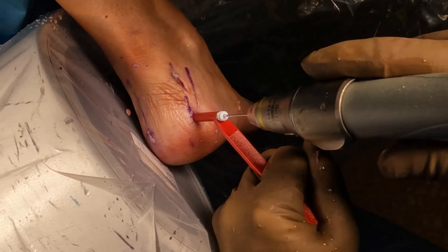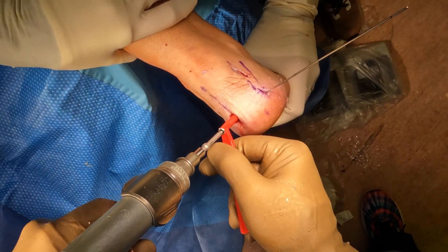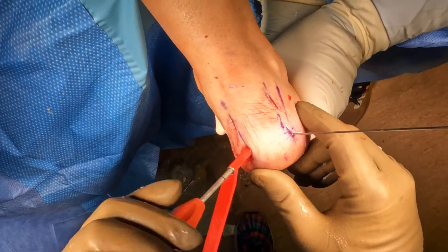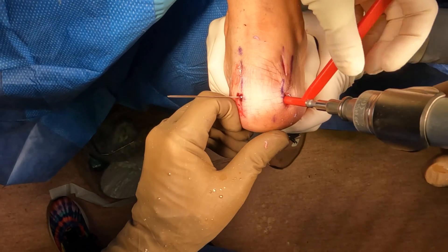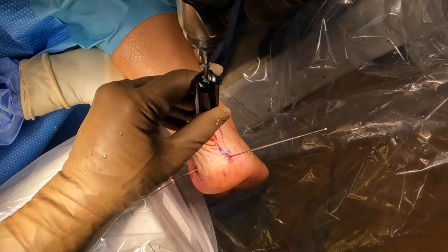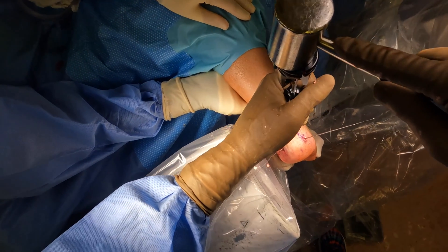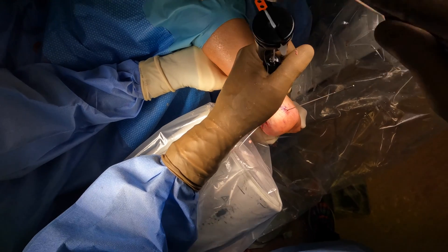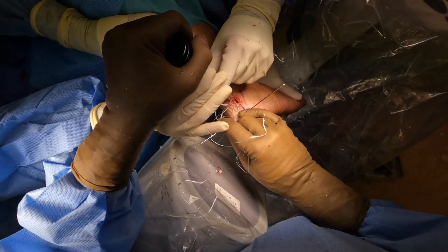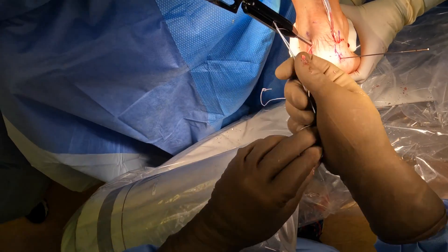The next step is to reattach the small portion of the Achilles tendon that was removed during this process. That's done through the insertion of anchors on the back of the patient's heel. There will be two inferior anchors, and then two superior ones. The superior ones are going to have knotless suture tacks, which will pull the Achilles tendon back against the heel, as well as two fiber tapes to insert into the anchors that go into the inferior portion of the heel.